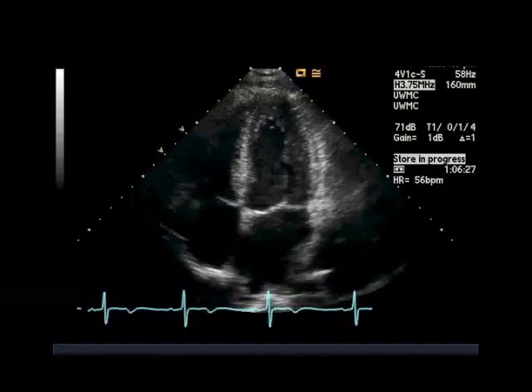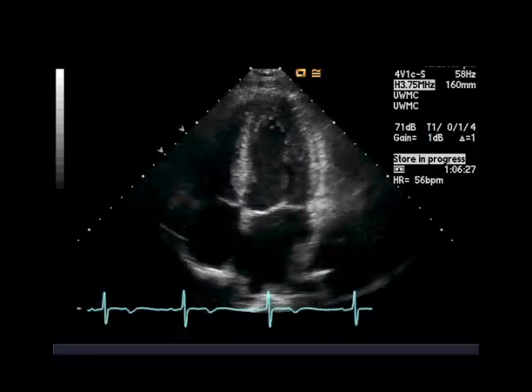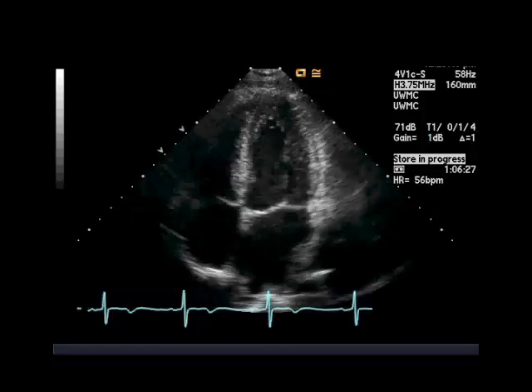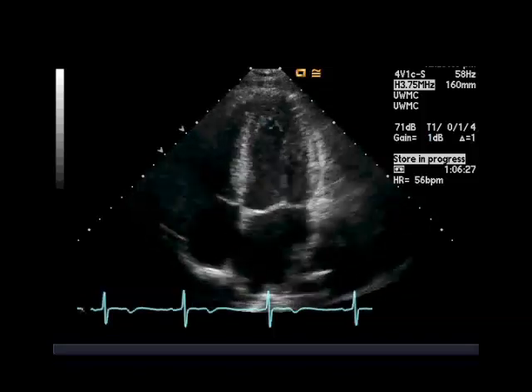The apical 4-chamber view is obtained with the transducer on the left ventricle apex. The convention for echo images is to show the transducer position at the top of the image because this allows correct identification of ultrasound artifacts. Image quality often is improved by having the patient hold his breath at held expiration.